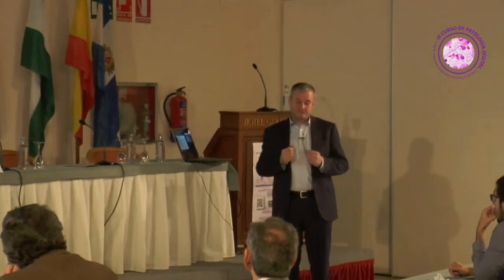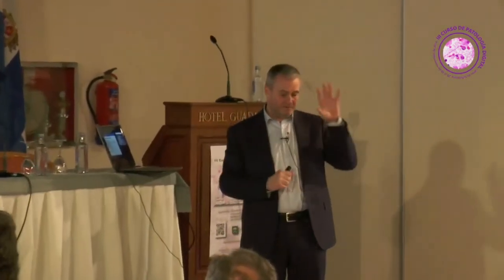Obviously there are two ways to do this. What I just described here is a field of view based approach where the pathologist is selecting a field of view and then eliminating stromal cells and also ductal carcinoma in situ, as the case may be. There I have to agree with you that it's not evident that you will get any productivity increases, and that tends to be a problem.